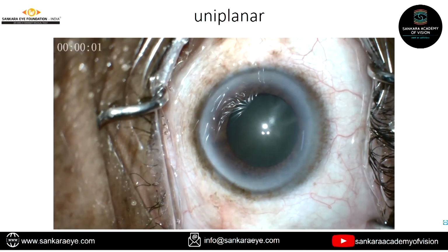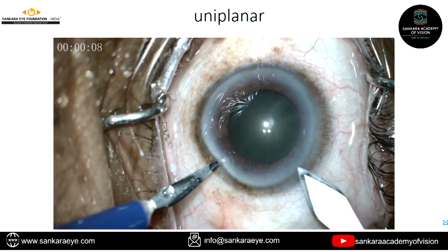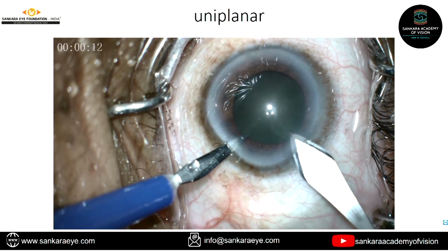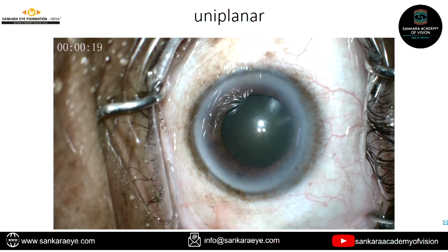So this is a uniplanar incision. That is, you have a single plane. You make a single oblique incision. This is for phaco. You can either hold the conjunctiva, or with the side port you can just hold on to the eye, and you see I'm just going diagonally, obliquely into the eye. It's just a single planar incision. That is a single oblique slit with 2 openings, okay? So that's a uniplanar incision.